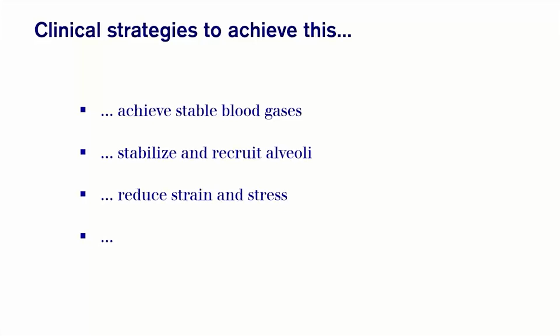Clinical strategies, there are many, but I think one is important: to achieve stable blood gases, stabilize and recruit the alveoli, and reduce the strain and stress in the lung.